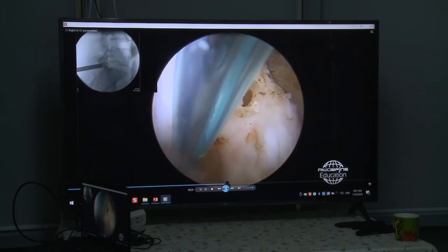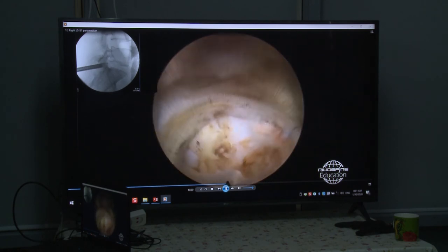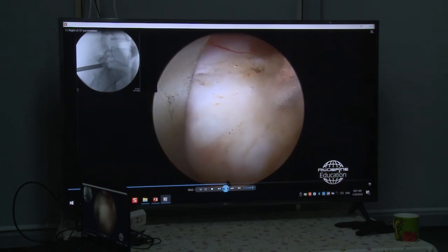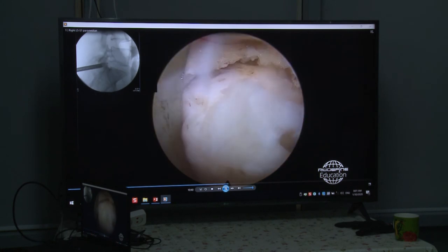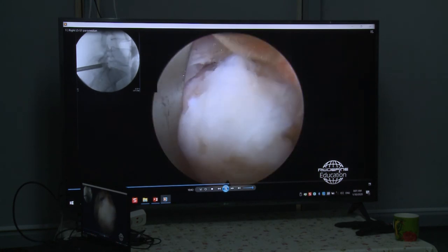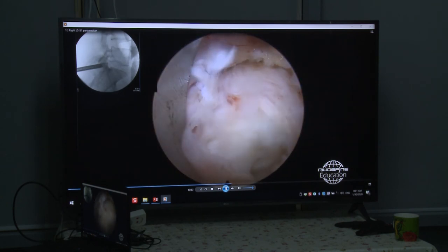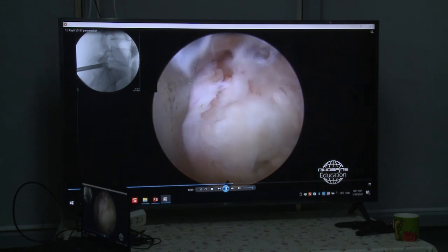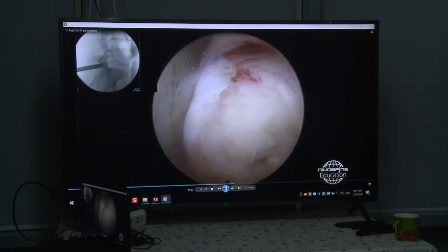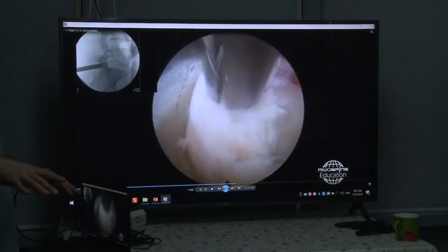Here we look in the foramen already. See a little bit? Now I open the PLL or the covering here of the herniation. So I recheck the sequestered material. Now we see the annulus here, and that is the PLL. Yeah. Already the operation is finished. The rest is just to look around and cut a little bit.